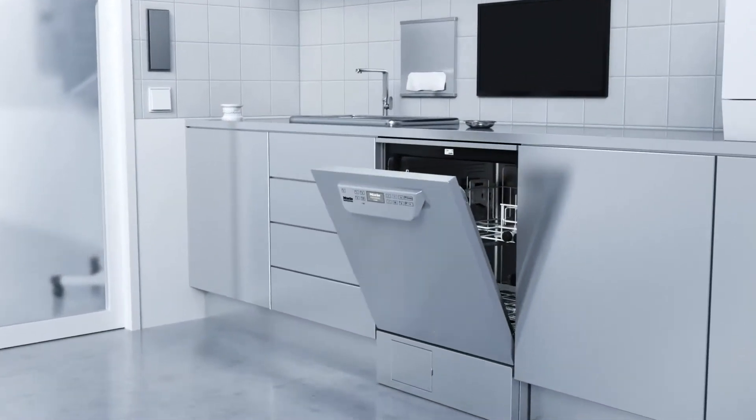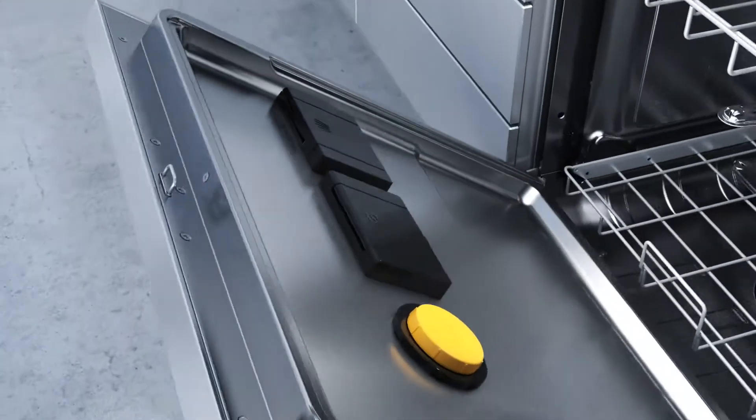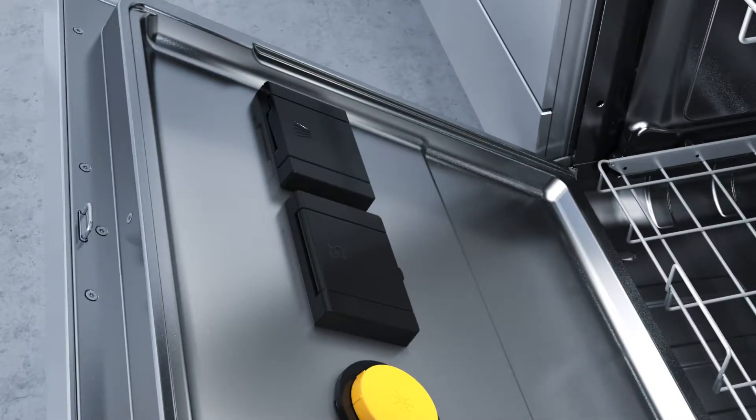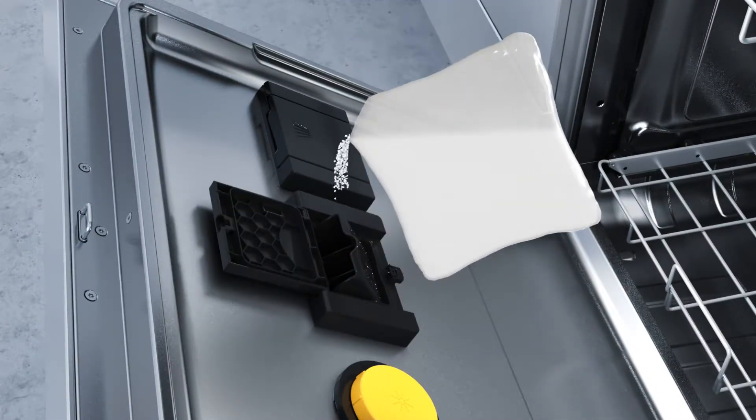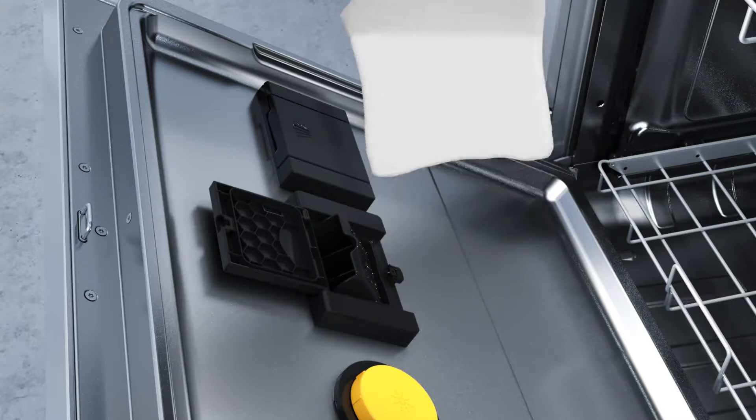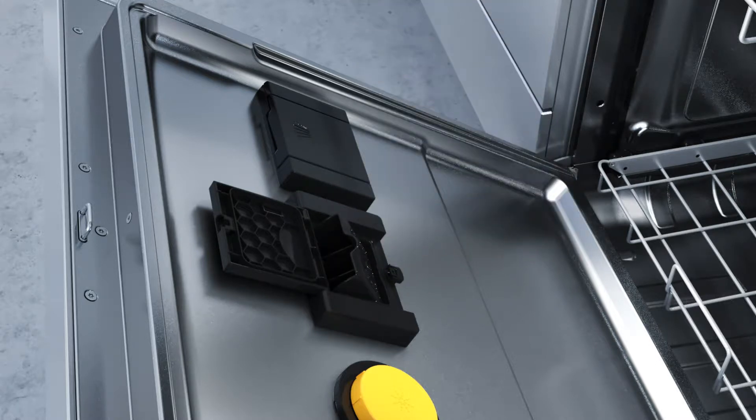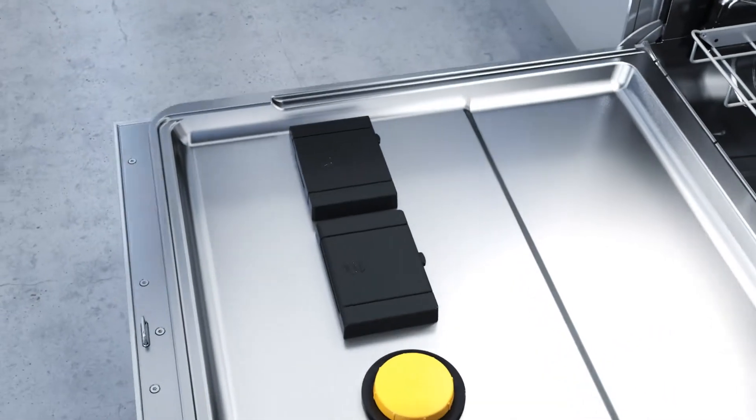Miele uses its wealth of expertise to create extremely convenient washer disinfectors. Ergonomic in the extreme, reactivation sort can be replenished via the door dispenser without any need to stoop or bend.